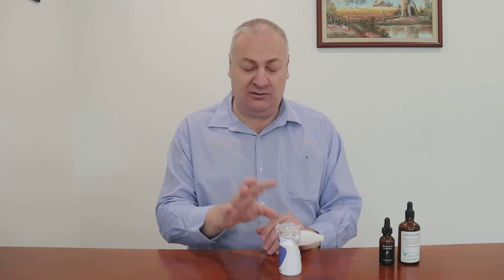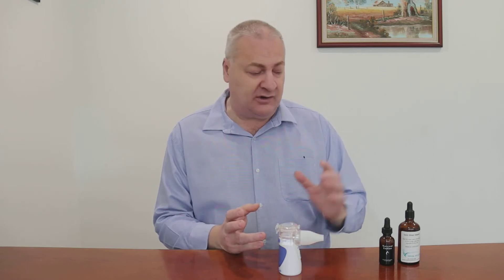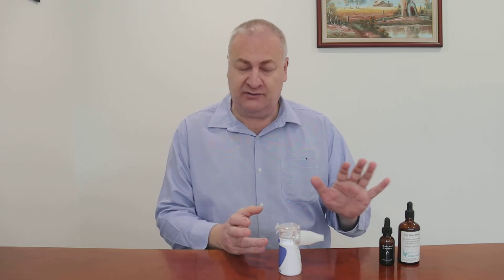Today we're going to look at some very quick instructions on how to use the little nebulizer. Potentially you could nebulize lots of things — it could be medications, it could be all sorts of things — but today I'm just going to show you a couple of things that I commonly use for myself.